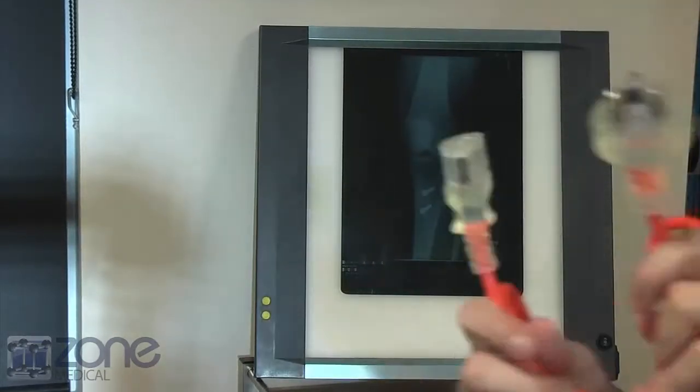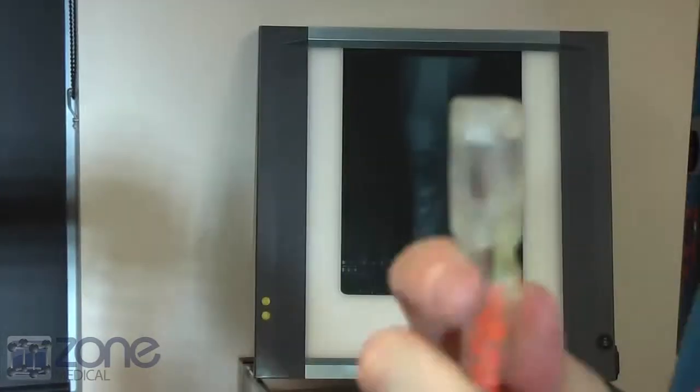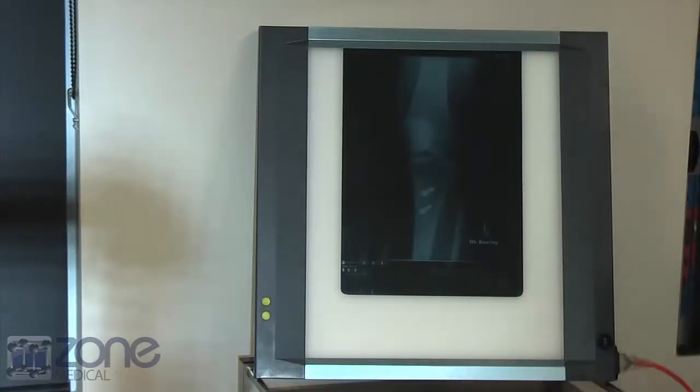Next, you will find the power cord. Place this into the side of the viewer and into any power point. This easy setup allows you to use the device immediately.